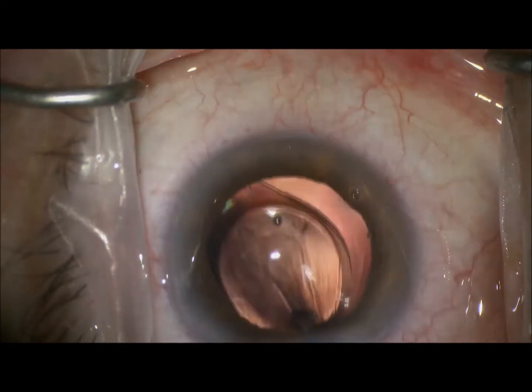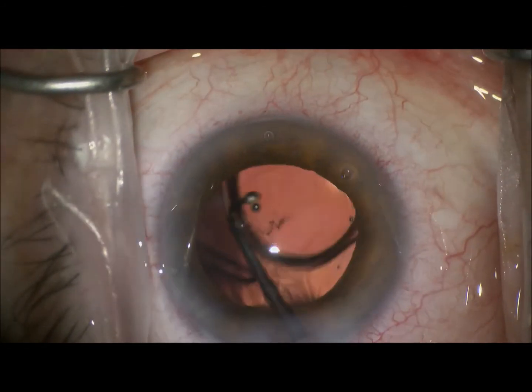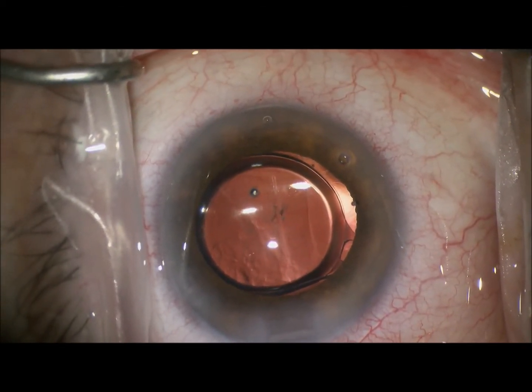You can see the lens unfolds fairly rapidly. We'll rotate it into position. The lens stays in position very nicely, which will be ideal for a future astigmatic version.